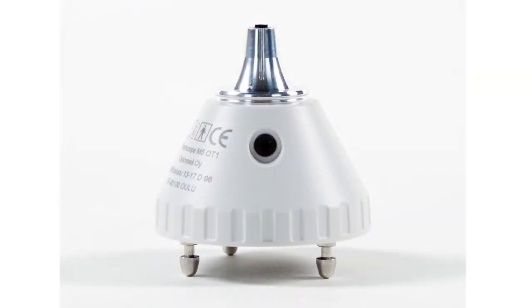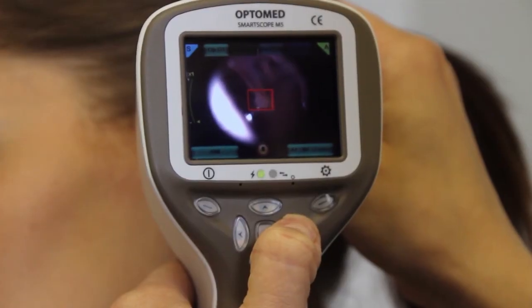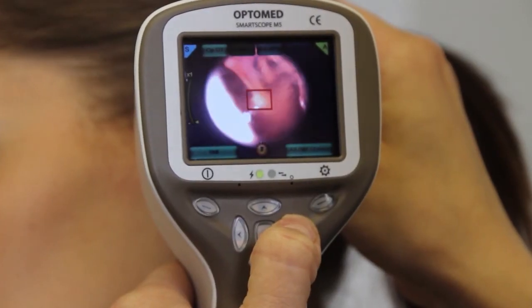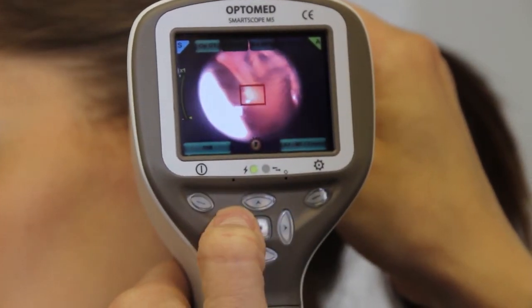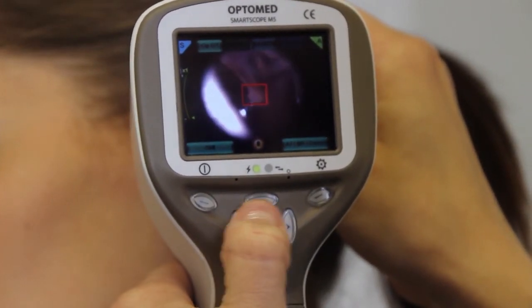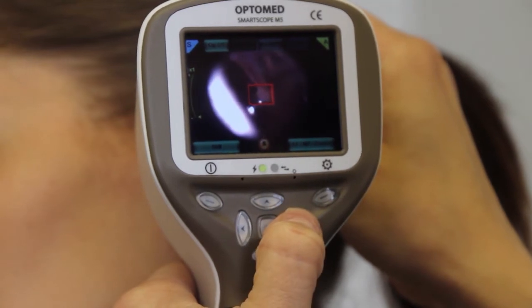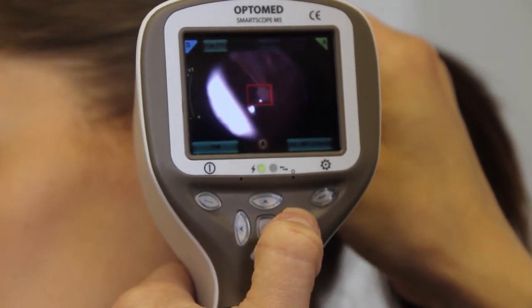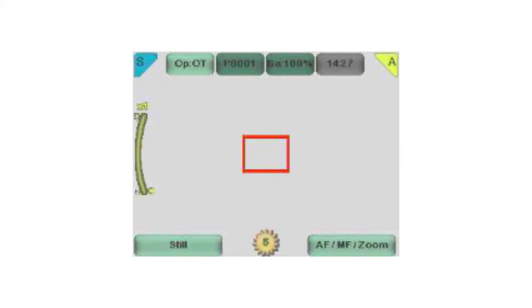Illumination level: the camera has white LED lights as a source. The level of illumination is adjusted by pressing the right and left arrow keys. Altogether there are 10 brightness levels with a default value of 5.